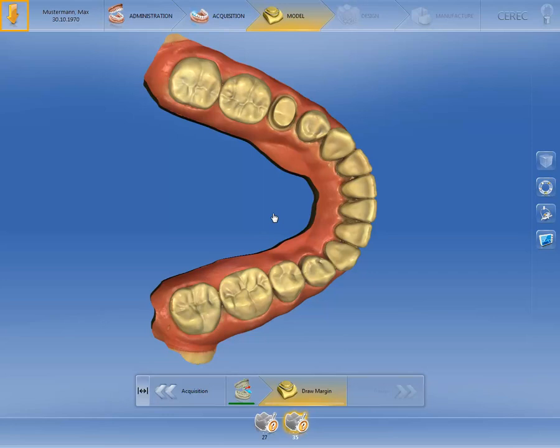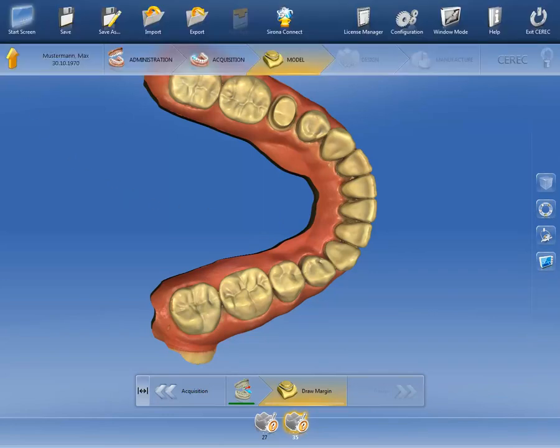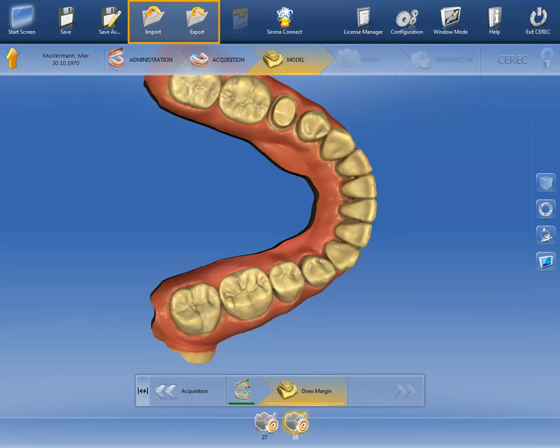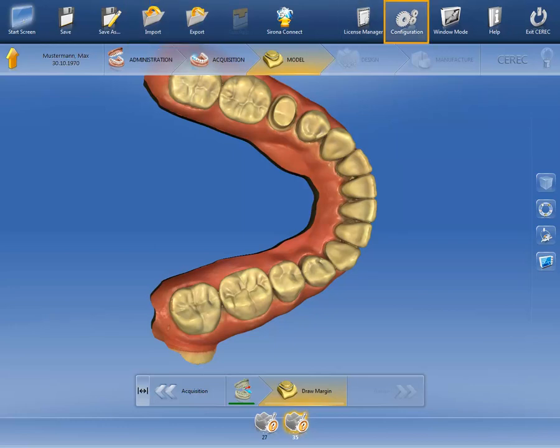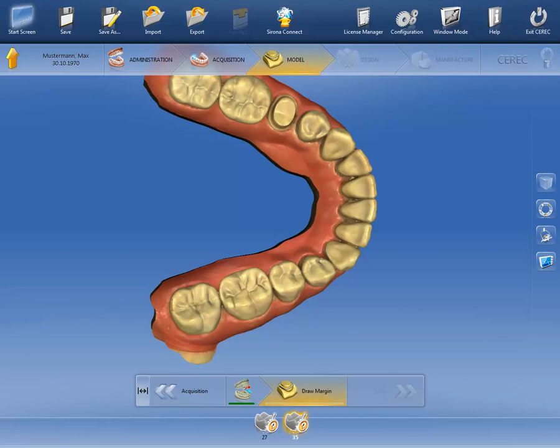To do this, we click on the orange arrow at the top left. Among other items, the system menu contains the sub-menus for saving a case, importing or exporting cases, the license manager, the hardware and software configuration options, and the option for exiting the software. Simply move the mouse back to the main window to close the system menu.